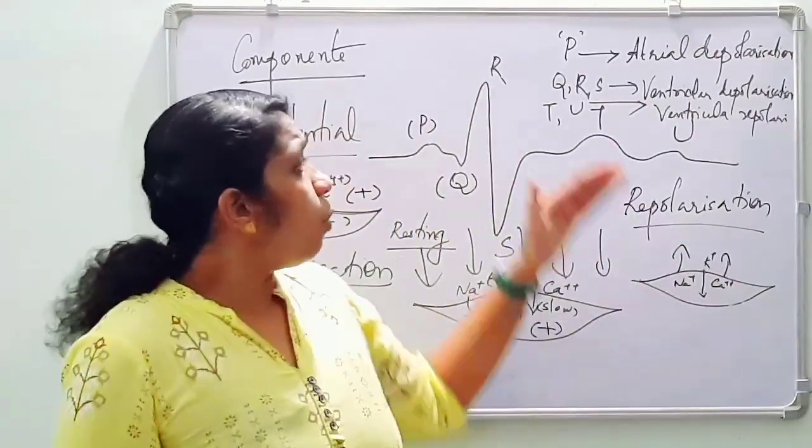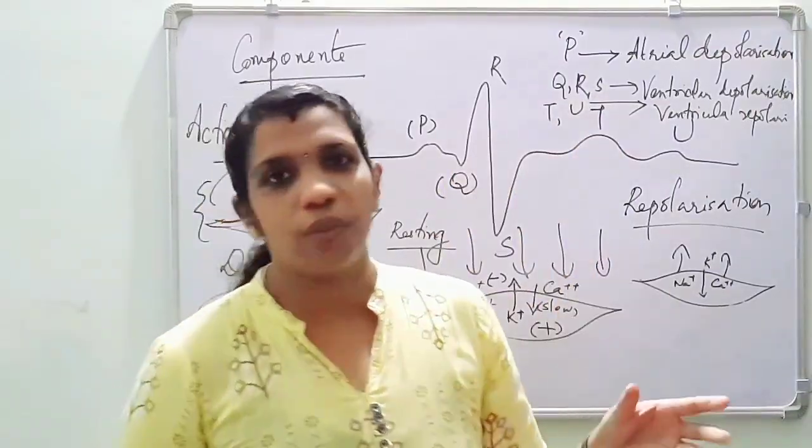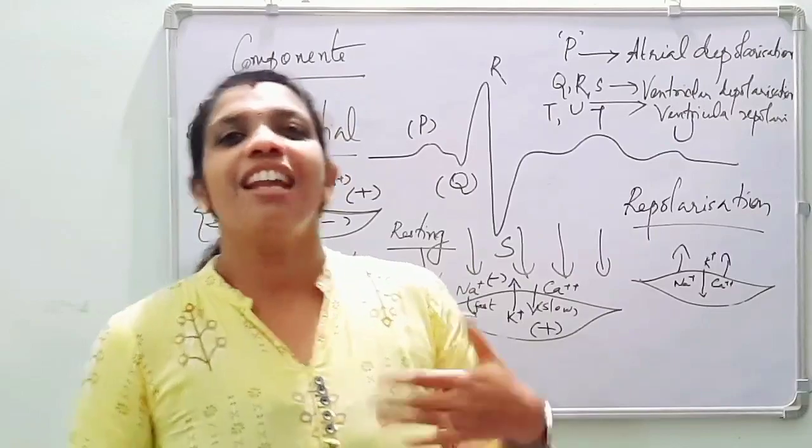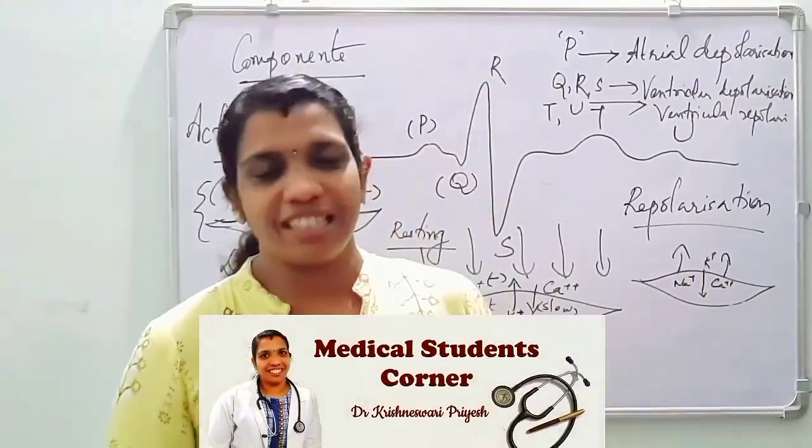So we told about positive and negative deflection, is it not? There is some process which leads to positive and negative deflection in the ECG paper, that we will be dealing with in the next class. So hope you have understood the session.